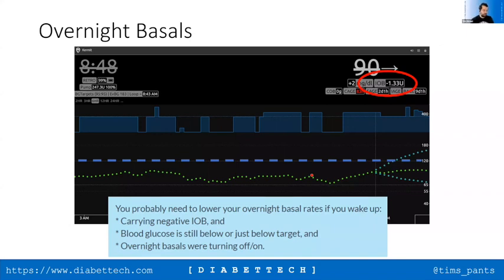So there's a question, how much IOB should be showing on wakening as an indication of basal being okay? So what your IOB indicator is a net IOB. So is it how much more or how much less than you would be predicted with your standard basal rates. I would suggest if you're between 0.0 and 0.3 above or below, it's probably not too much of an issue. If you're greater than 0.3, then you might want to start considering making some tweaks. I think that's probably a reasonable rule of thumb. But obviously it's up to you to make the decision on that.